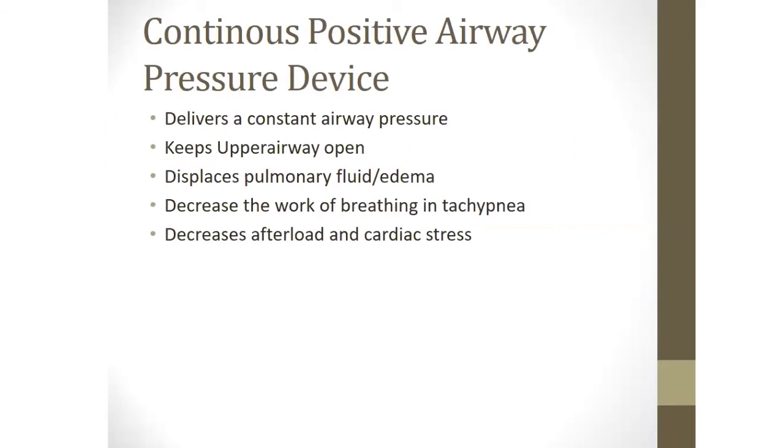The continuous positive airway pressure device. Basically CPAP is equal to PEEP, which opens the airway and continuously delivers a fixed pressure, which improves oxygenation and improves ventilation perfusion mismatch.